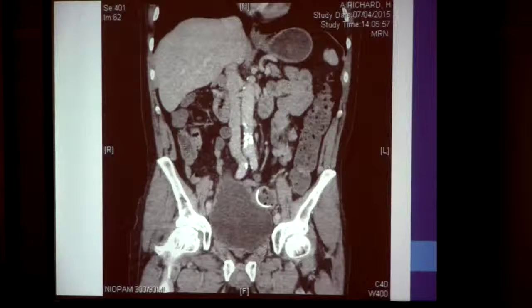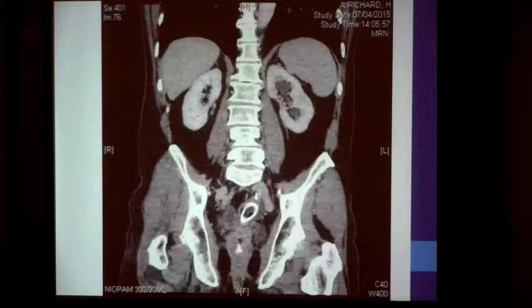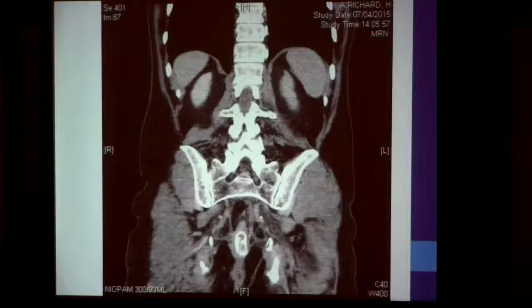This is a CT scan picture of the stent. If you follow the series of images down, you'll see how the stent keeps the tumor open. In this particular patient, I've actually put in two stents because the patient had tumor overgrowth, and I put in a second stent about 12 months after the initial one.